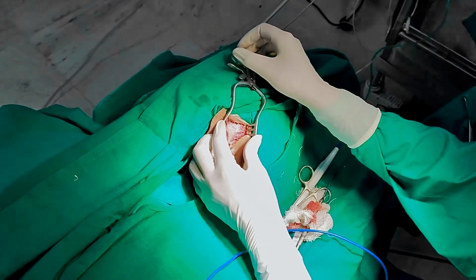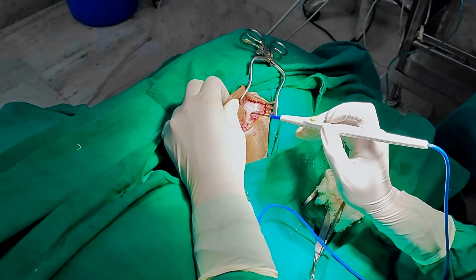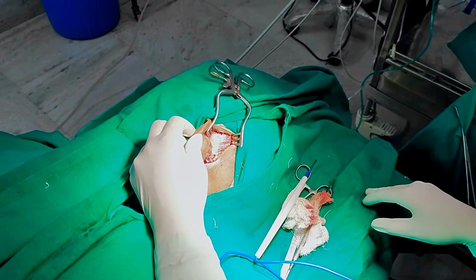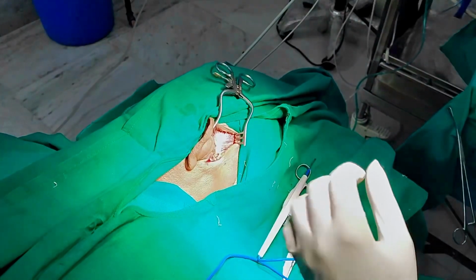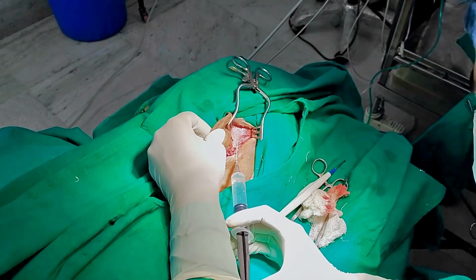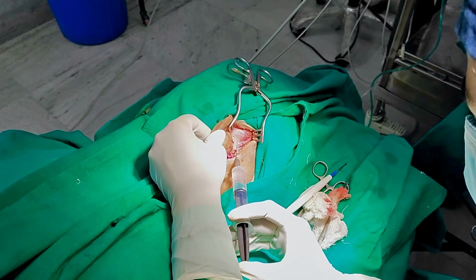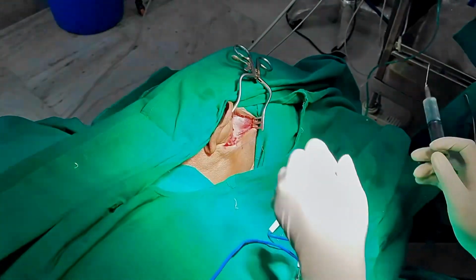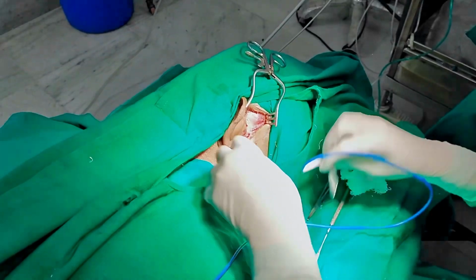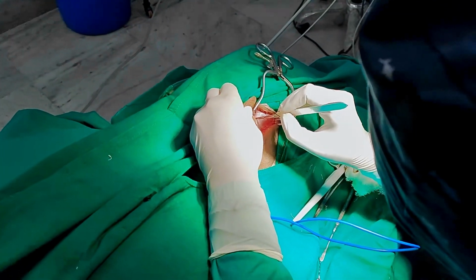As you can see, the surgeon is now exposing the area further. This procedure is called hydrodissection, where we place water between the temporalis fascia and the temporalis muscle, so that the temporalis fascia is separated from the muscle because of the pressure of the water.